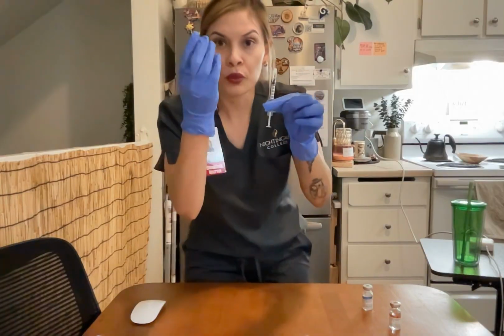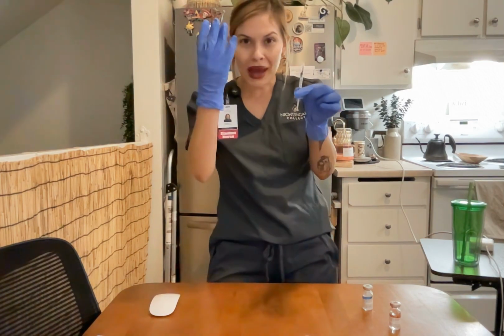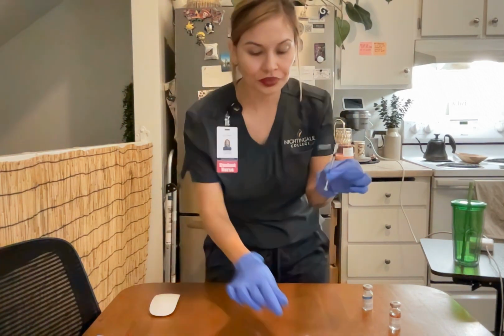Also, while withdrawing the medication, I make sure that I do not overdraw too much NPH into my syringe.